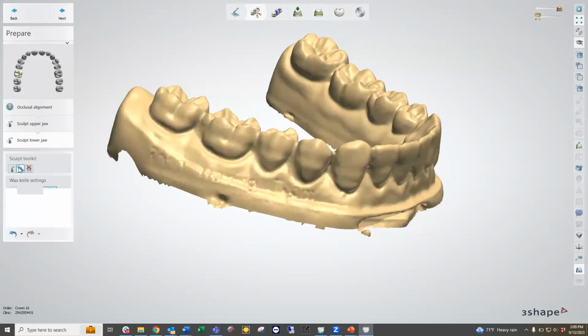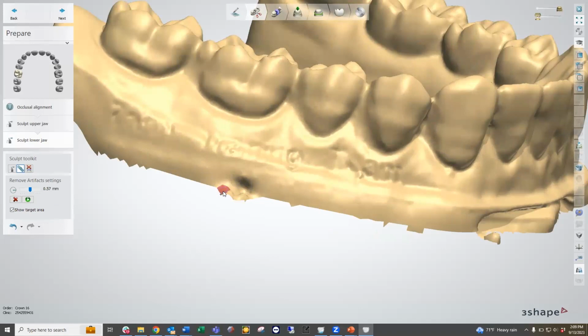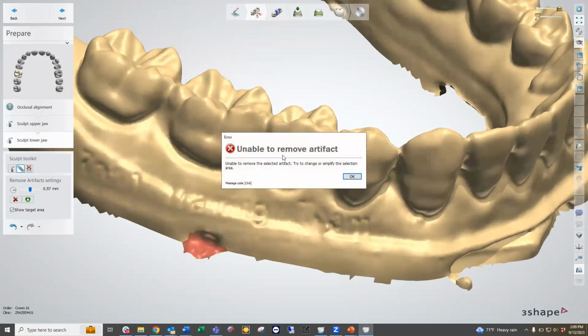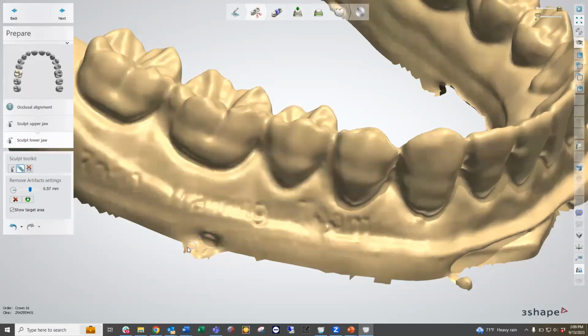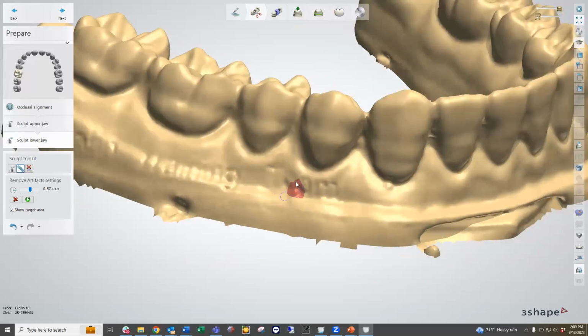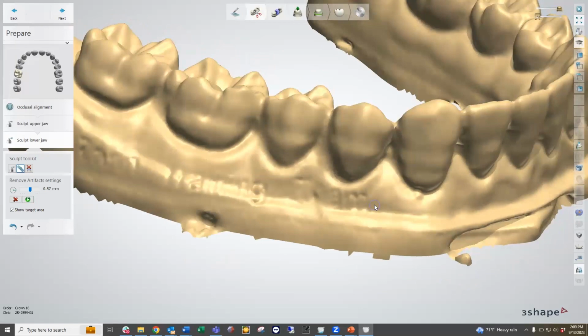Another option that we have during the stage is the remove artifacts tool. And this one just allows us to go ahead and paint an area that might be of concern. So if you see any sort of funky triangles or any sort of areas within the model that don't look true to the actual model itself, we can highlight that and hit play, and it tries to remove that artifact. With this one, since I'm enveloping on an outside area, it won't allow me to do it. It only allows us to highlight areas that are internal or fully engulfed in triangles on left and right sides. And it basically just takes that area and it smooths it out.